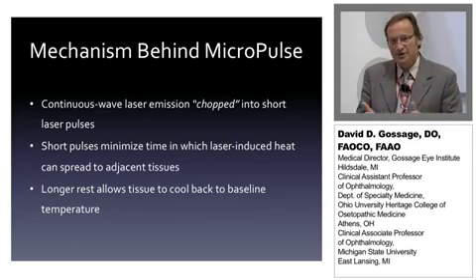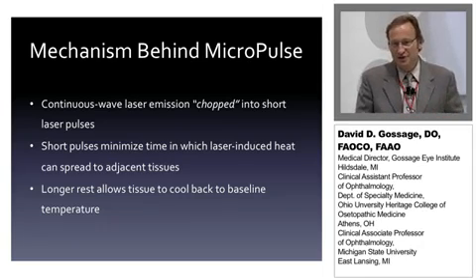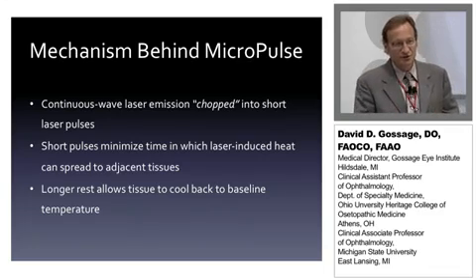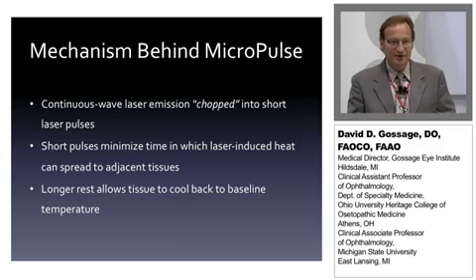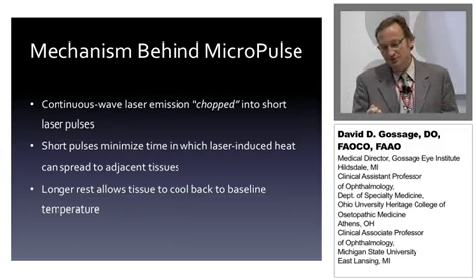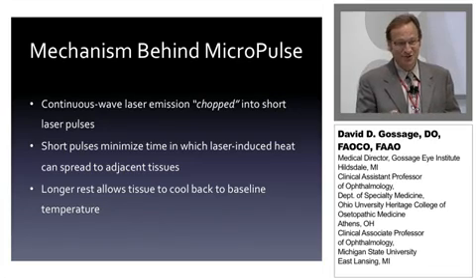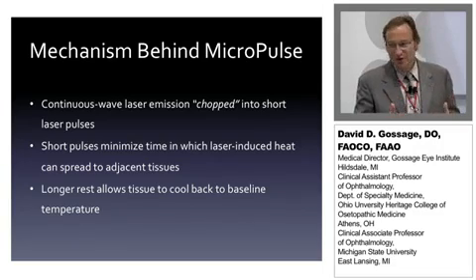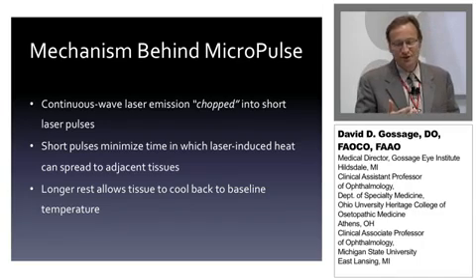It's kind of like if you're a phaco surgeon and you know about phaco technology. When you get into the duty cycles of certain machines, like the WhiteStar system, it was designed to not cause a phaco burn. If you held onto that phaco tip and you put it into a duty cycle, the heat wouldn't generate enough. But as soon as you take it off the duty cycle and you put on continuous power, you'd burn your hand in about a second or two. So the idea behind this is that you're going to try to generate elevation in the tissue temperature but not cause any thermal destruction.